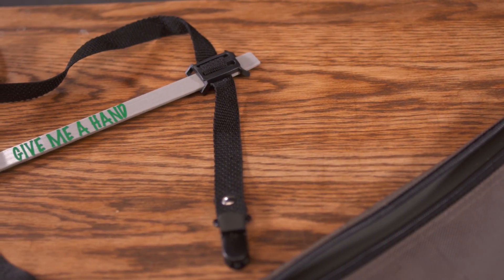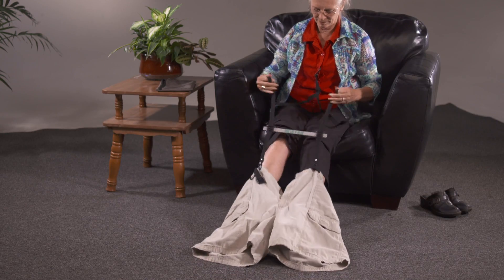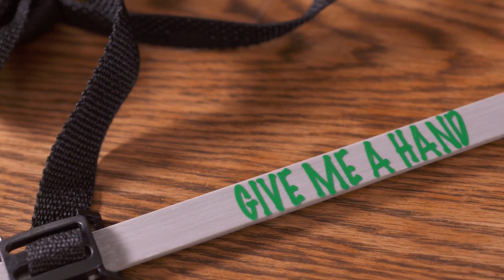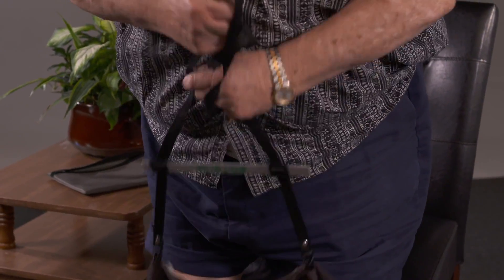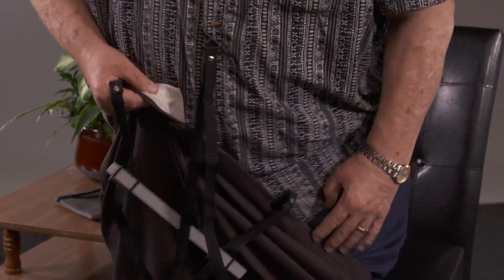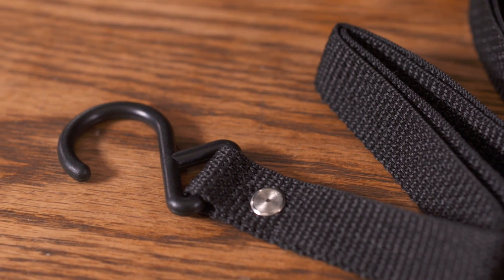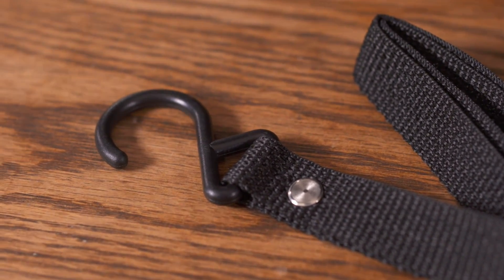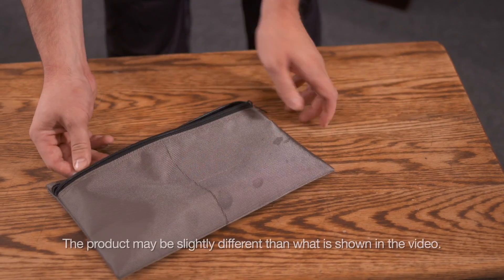If you have difficulty dressing due to surgery, injury, aging, limited range of motion, or other challenges, this video is for you. Give Me A Hand is a dressing device that primarily assists with dressing the lower body. It requires less grip, dexterity, and strength than other dressing devices. Its design features allow hands to be free for additional steps. Since I have back problems, I've used Give Me A Hand for several years and it works great.